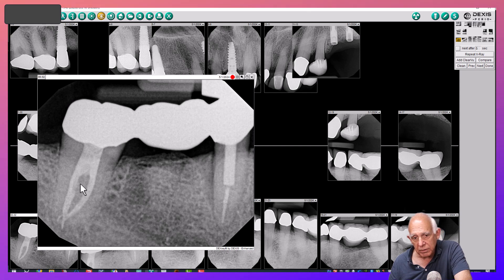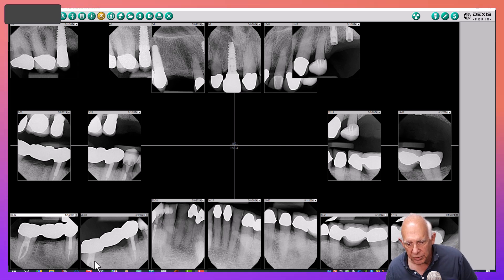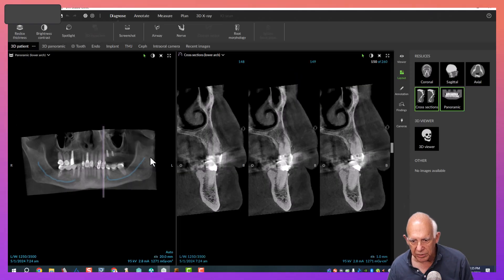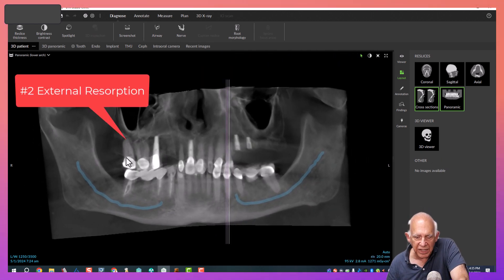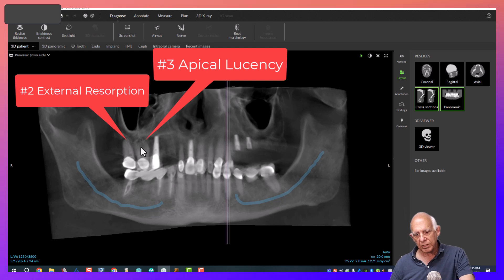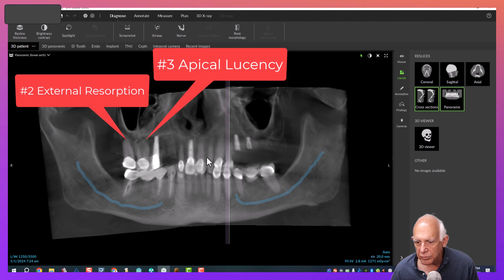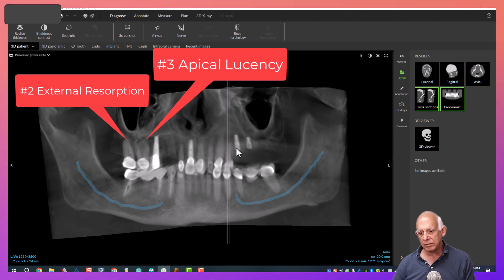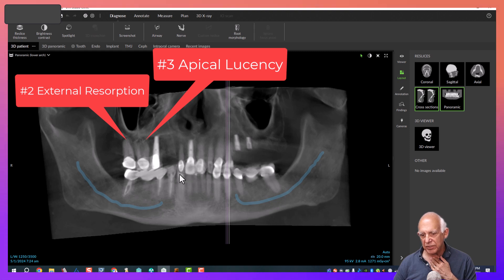Summarizing the findings on the panoramic: tooth number two has external resorption from the palate; tooth three has an endodontic problem on a crowned tooth; tooth four is doing well; everything is okay until teeth twelve, thirteen, and fourteen, which in my opinion are non-restorable. On the lower arch everything is doing okay except for the severe overlap and tooth number 29, which is failing.